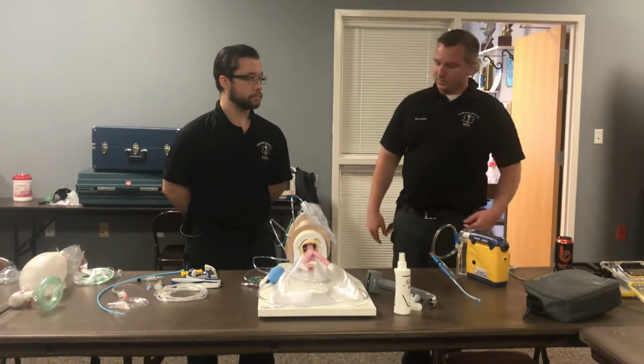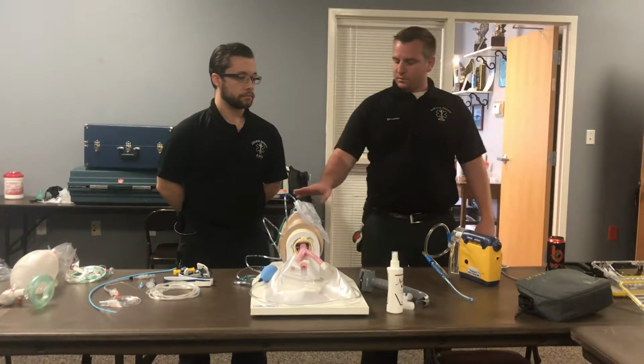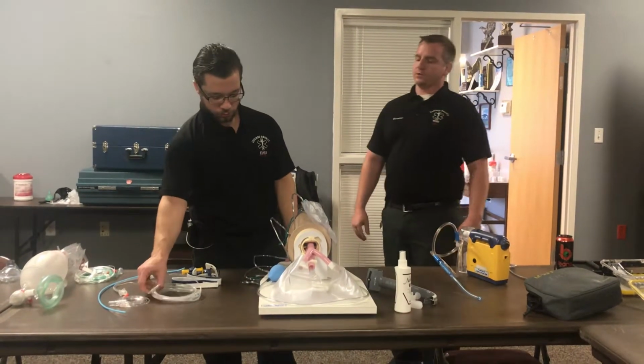So we are going to step through the RSI procedure the way that Dr. Brott wants us to do it. So Levi already has a non-rebreather on this patient. He is going to also place a nasal cannula.